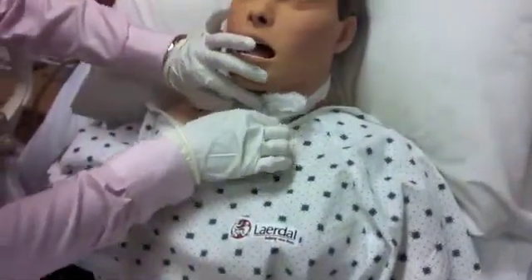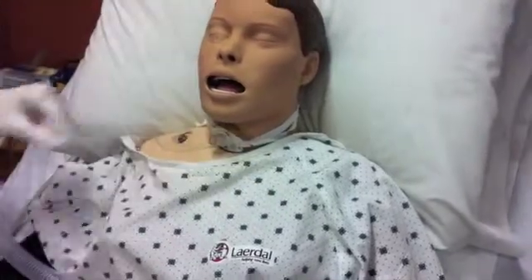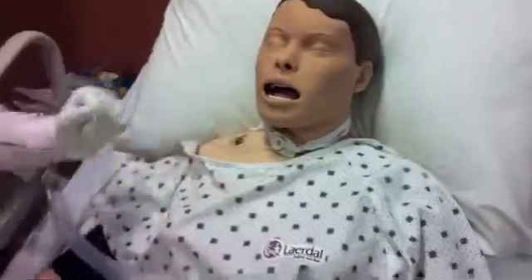Remove the dressing from the patient and assess the stoma. Remove the inner cannula and place it into your saline. Now put on your sterile gloves.